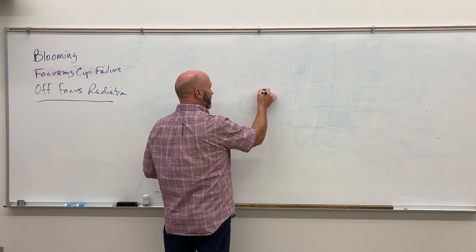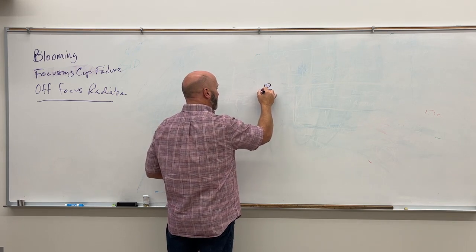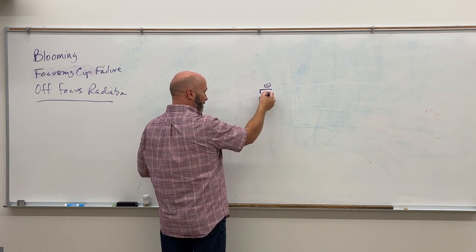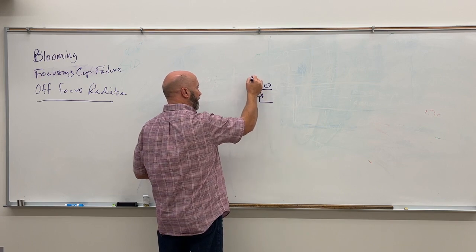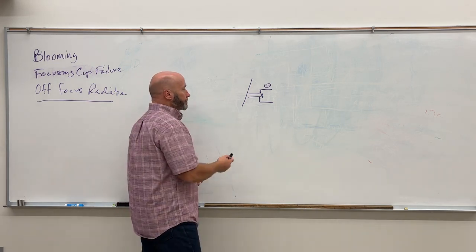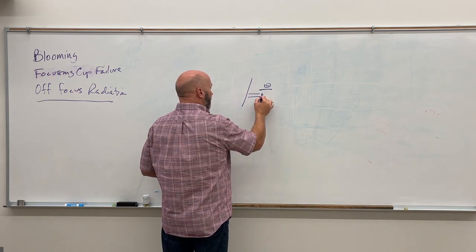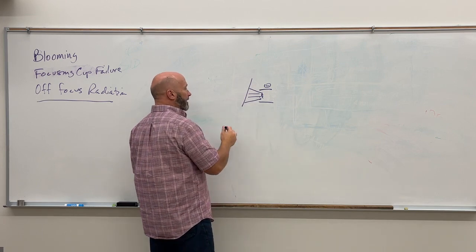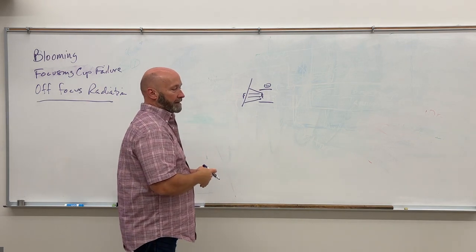All right, so we talked about the focusing cup. It's negatively charged to compress the electrons that are boiled off of the filament, so that whenever they travel across the tube, they don't spread out and they interact where we want them to interact on the focal track. If we don't have that negative charge, then our electrons can spread out and interact on the target aside from where we want them to interact. Again, reducing the sharpness of recorded detail.